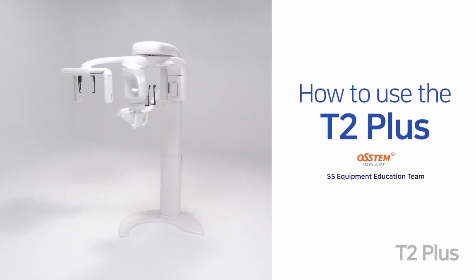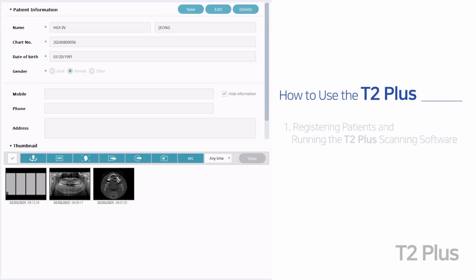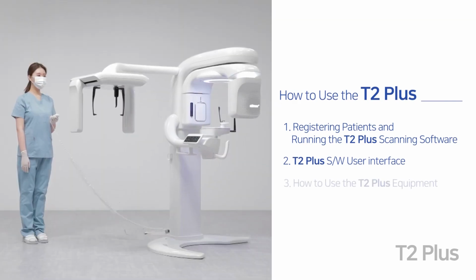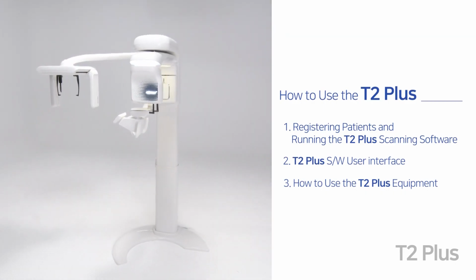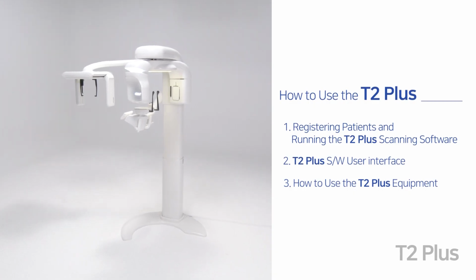Let me show you how to use the T2 Plus. First, registering patients and running scanning software. Second, the T2 Plus software user interface. Third, how to use the T2 Plus equipment. We'll be looking at using the T2 Plus, focusing on these three areas.